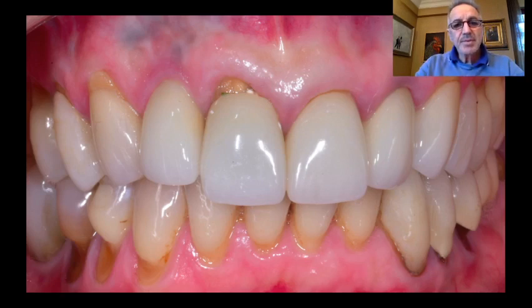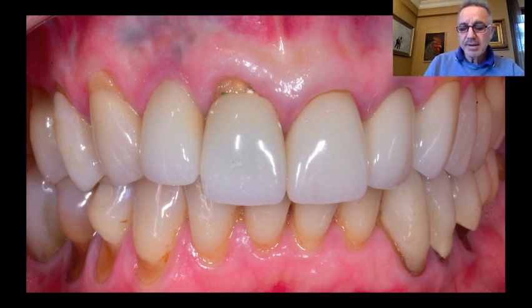This patient came to me like this. As you can see here, there is some amount of recession, a small fracture, and mobility of tooth number 8. This part has been broken, and due to the mobility, the patient feels some malodor around tooth 1-1.